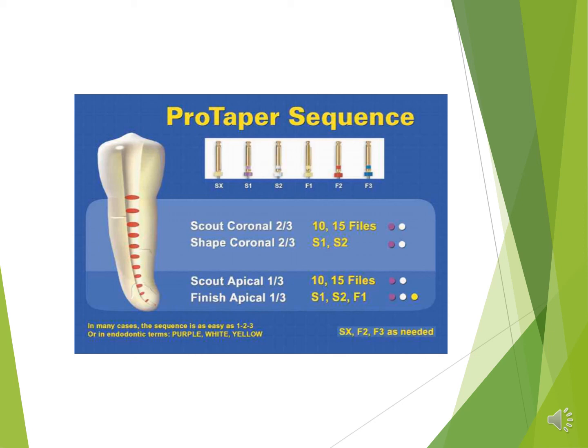During the entire shaping procedure, I prefer to use sodium hypochlorite as irrigating solution. As I said, there need to be some precautions taken when you are using Protaper sequence. It's very important to get a straight line access while preparing the root canal. Multiple use disinfecting and re-sterilization cycles may lead to increased risk of file separation.